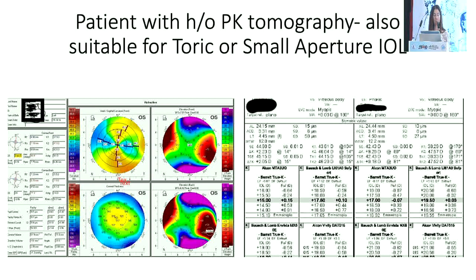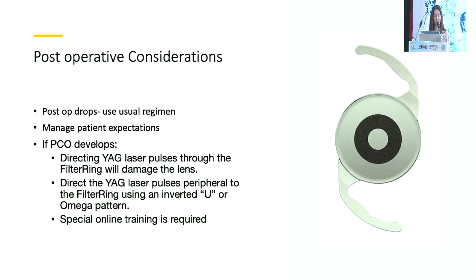Patients post-PK, I'm a big toric IOL user in post-PK patients, and I do femtosecond laser relaxing incisions at about 7 millimeters at the time of the surgery, and find that there's a synergistic effect. You can also use a pinhole lens here. I have not done that yet, tend to use the toric lenses and such.